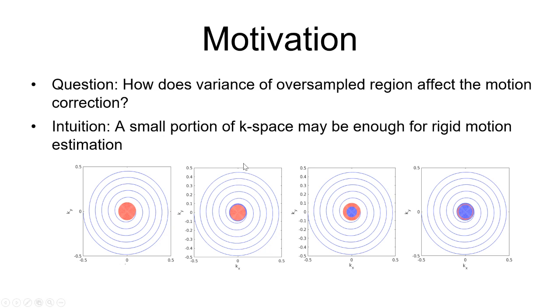It is highlighted in red in the leftmost figure below. Well, can we use a small circle instead? Sure. Can we drop the information at the center of k-space? Probably. To significantly improve the imaging efficiency, maybe we can use a very thin ring.